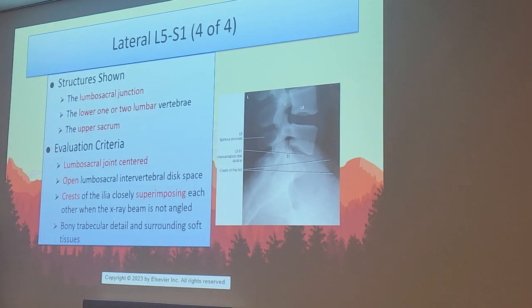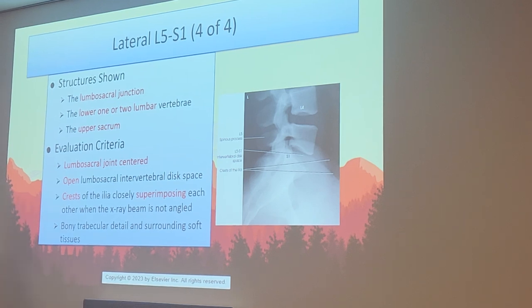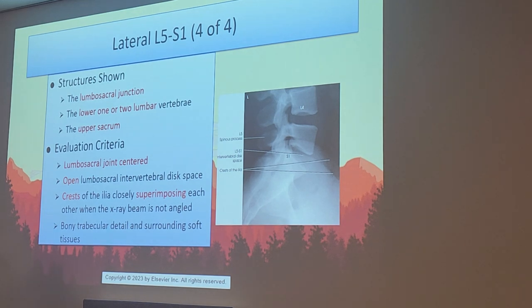Now we want the open disc space. We achieve that by the positioning combined with angulation. Crests of the ilia should be as close to superimposed as possible. That confirms to us that the hips are not rotated. We want to show that they're on their side in a complete true lateral. By the way, not just the hips, you want to check the shoulders as well, because even if the top is rotated, it's going to rotate everything. Make sure you check the top to bottom. And then good tight collimation, getting that nice detail around that body appearance.